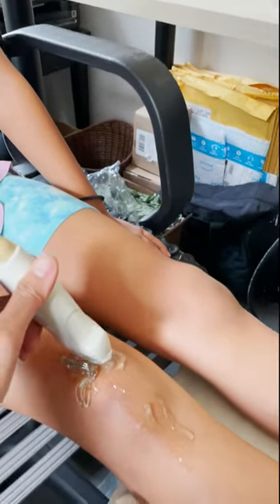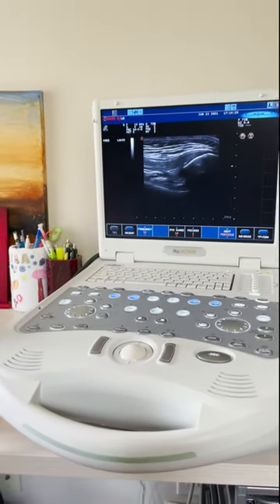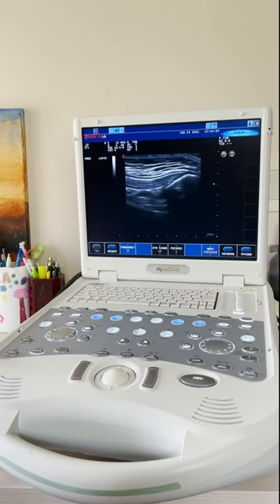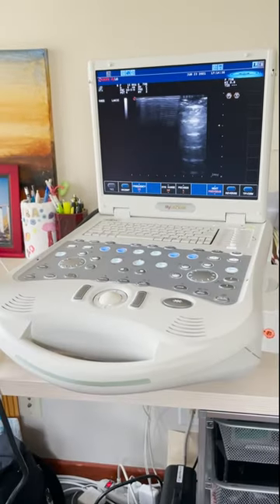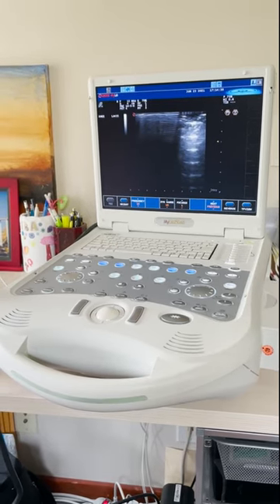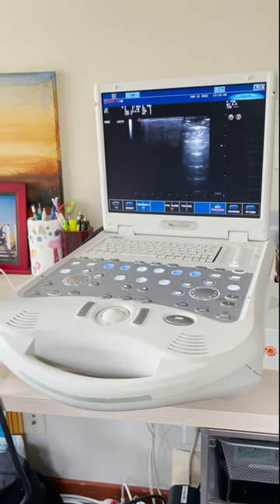Here we are going to look at Kira's knee. What we are seeing on the screen is where her quadriceps tendon attaches to her patella, and underneath that is her joint space. Ultrasounds are fairly quick and painless. They can take anywhere from a few seconds to a few minutes or even an hour, depending on how many body parts are being scanned.